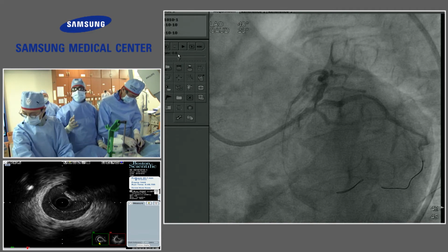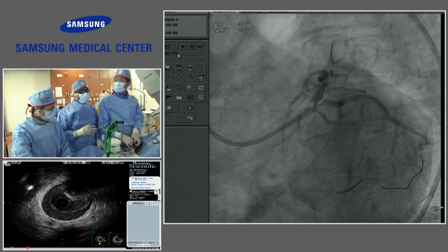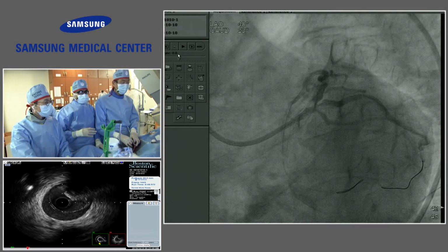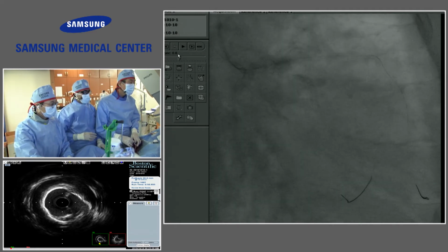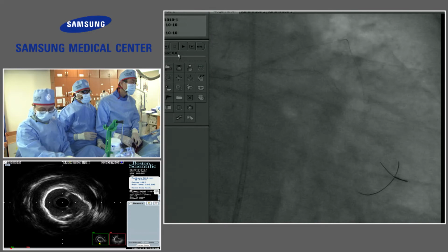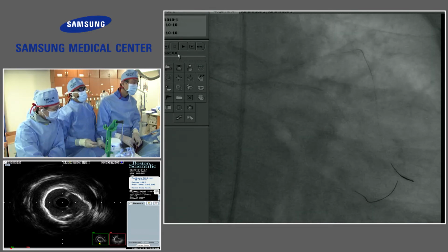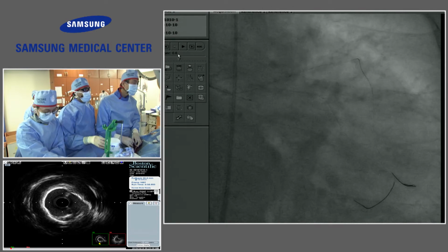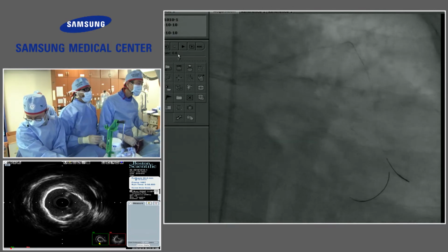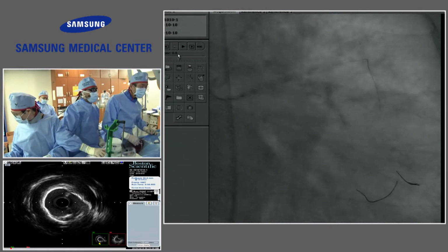We're going to swap over from the IVUS to the LAD. One of the questions for the panel, of course, is how much does that ostial flap, which is very thin, concern you? Maybe guide in. Any comment from the panel?